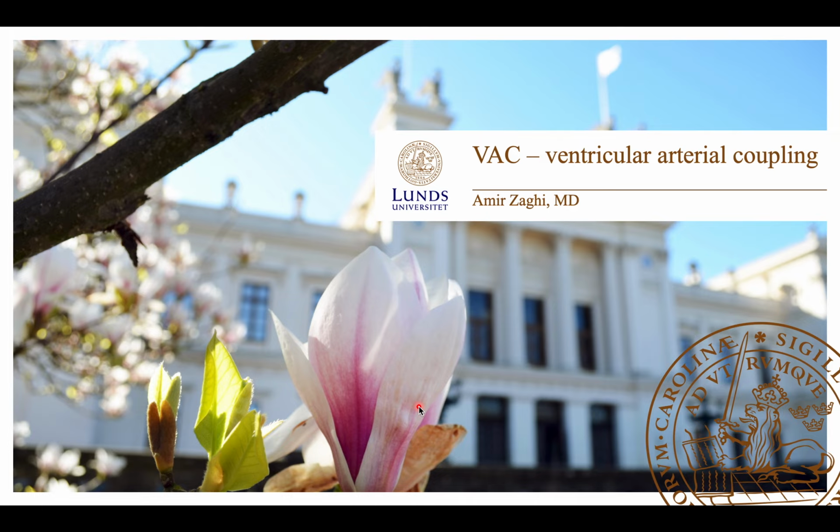VAC, or ventricular arterial coupling, quantifies how efficiently the ventricle and the arterial tree interact. I'll start with a physiological background, then a step by step measurement procedure, and finally, clinical examples showing why this ratio adds value beyond ejection fraction.